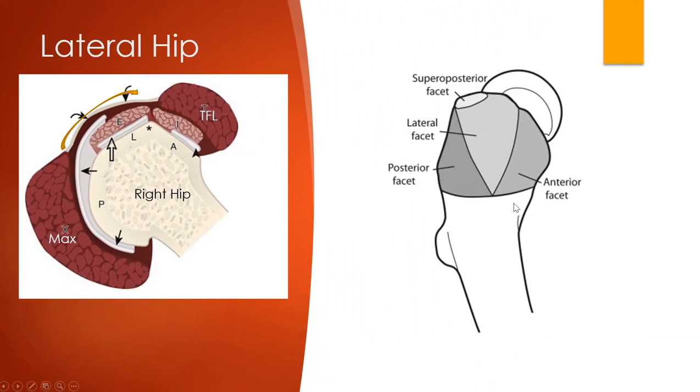Briefly, if we're looking at the lateral greater trochanter, we see the anterior facet. This is the footprint of where minimus inserts. This is the footprint of where lateral facet medius inserts. And then right up high here, which is why we don't see it in this view, this is the second sort of thicker, stronger, more posterior band of medius. The posterior facet is largely just a big bare area where the bursa sits. So maximus sits very closely opposed over here.